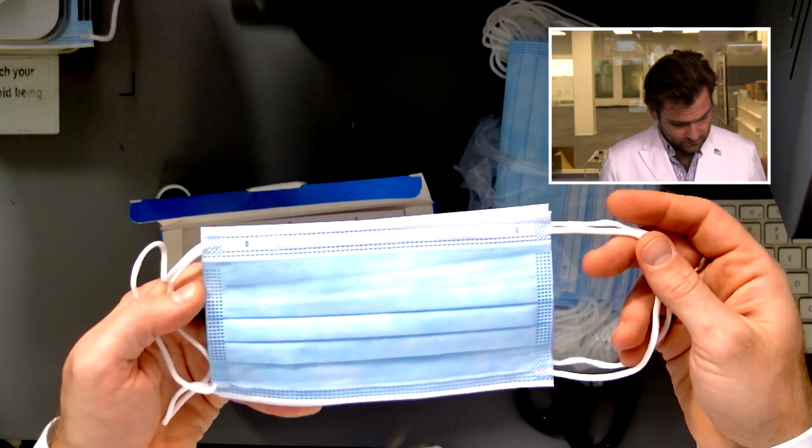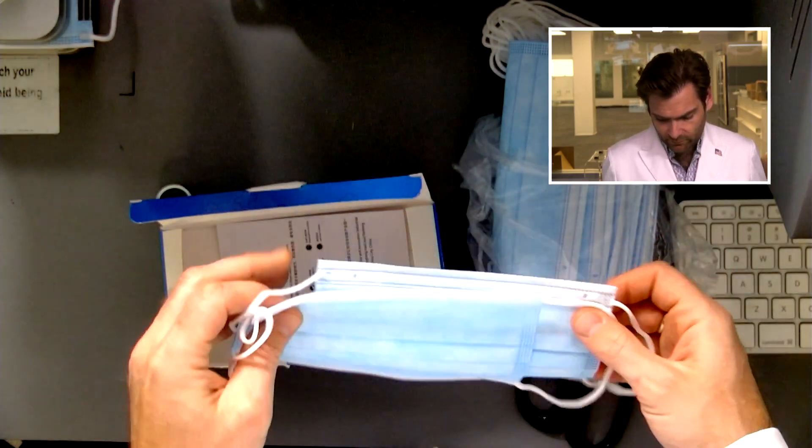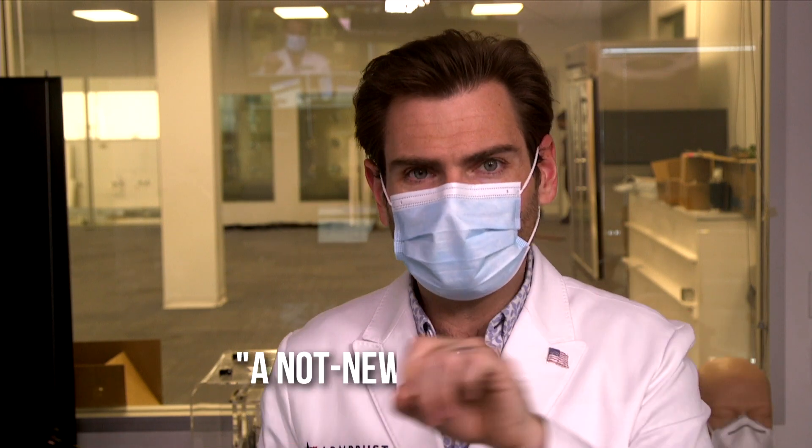It's a very high quality mask. The spunbond is giving me that cloud effect, which is pretty good. I can tell the ear loops might break — this is probably, of the 510(k) masks we've had, the weakest ear loops. The smell I'm going to call a 'not new car smell' — a car that's perfectly clean but just doesn't smell like a new car anymore — which is a first for me for a medical mask. All the welds seem to be lining up. The ear loops feel like they could be a little bit stronger, but I don't think it's going to break on your face. It's pretty good.